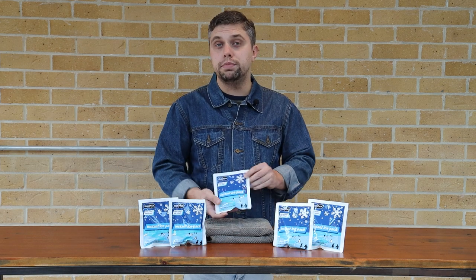Unlike other ice packs on the market, the Medipro Ice Pack is fully CE accredited and is a certified 2A medical device. Now I'm going to show you how the new Medipro Ice Pack works.